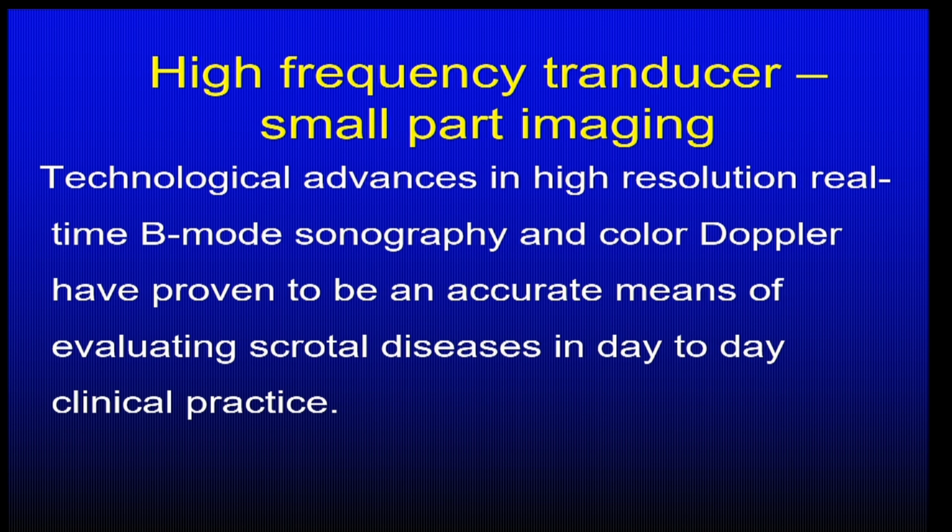I endorse very strongly that I remember my residency days where the linear probe was kept packed in a glass cabin and it was allowed to be used only by my lecturer and associate professor. But you guys are very lucky that this linear transducer lies on your machine now. Technology, time has changed in such a big way. I remember doing scrotal ultrasound on a convex transducer. If you were your lecturer's favorite, then only you got to use the linear transducer. Technology has evolved so much that high frequency linear transducers have completely revolutionized the way we can look at any small part imaging in the human body. Right from the thyroid, the breast, the scrotum, you can do beautiful analysis of clinical pathologies in day-to-day practice.